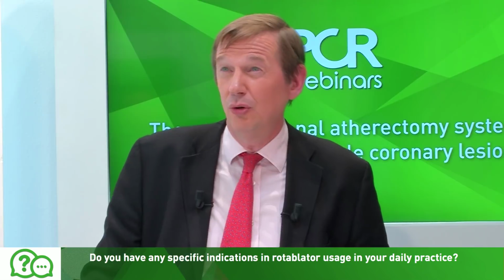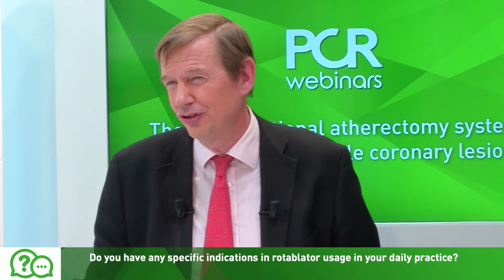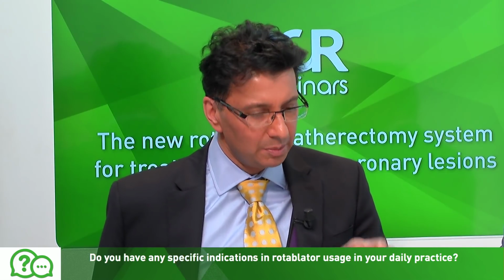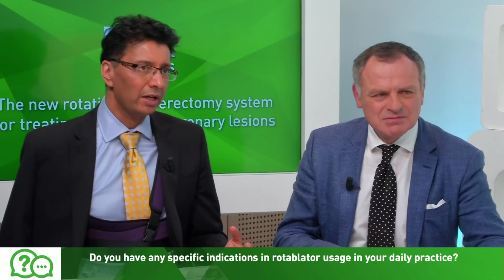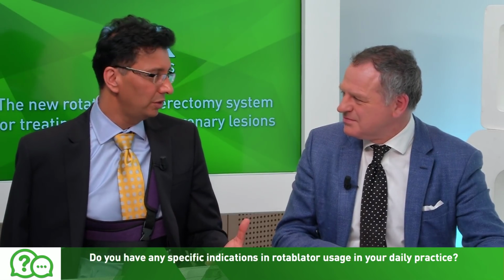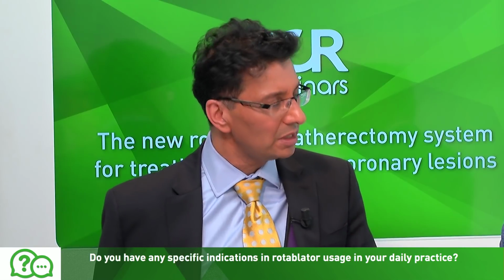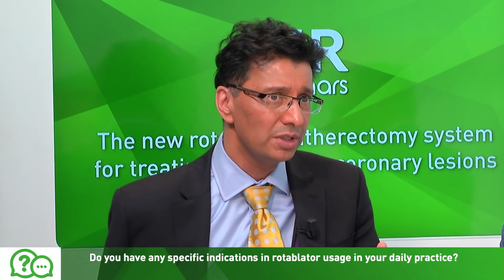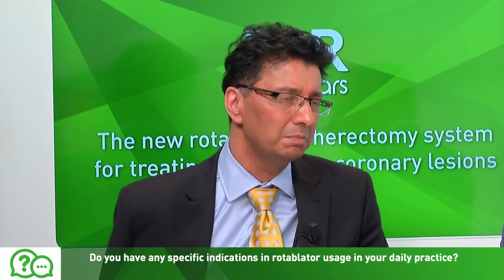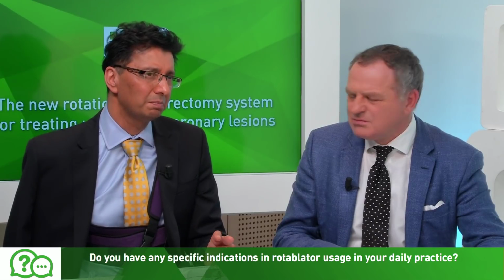There is some data, although none of it's randomized, about bifurcations, trying to avoid carina shift by debulking the ostium of the side branch. Have you? Not in your practice? No, not in my practice. Sagar, have you seen anything? I've used it in bifurcation. The primary indication has to be calcified anatomy. Yeah. I wouldn't use it in non-calcified. I think you're going to get yourself into trouble, and people question whether or not that's the right thing to do. So as long as the anatomy is calcified, then yes, it's reasonable to use it in a bifurcation, but not per bifurcation per se. So I certainly wouldn't do that.